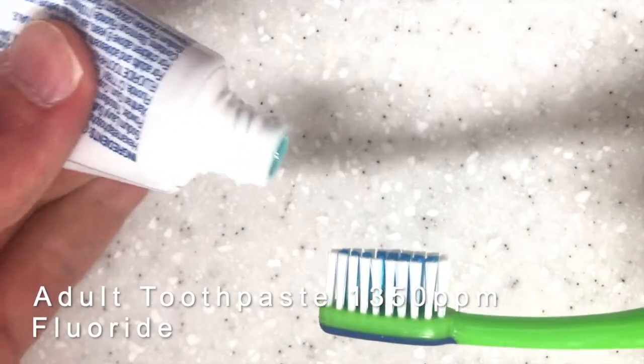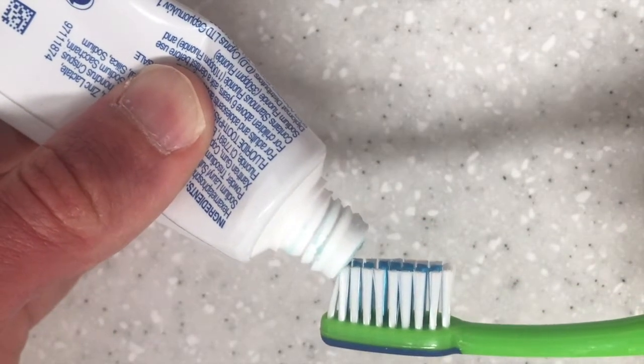You need to make sure that you're brushing your teeth every day twice a day. You just need to put a nice small pea-sized amount of toothpaste on your toothbrush, just like this.